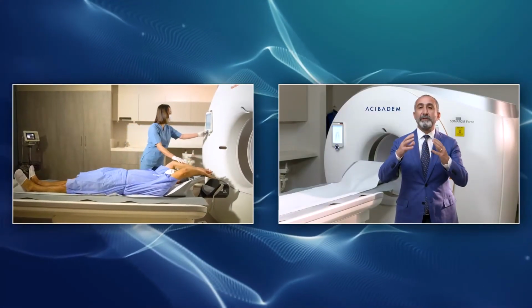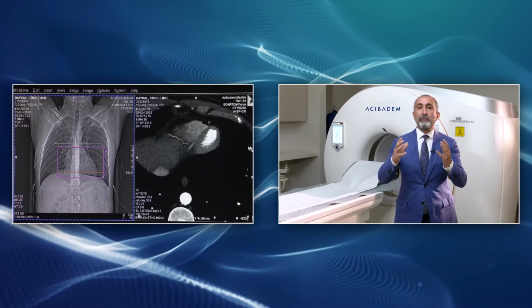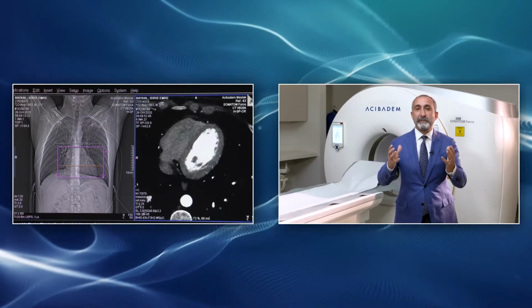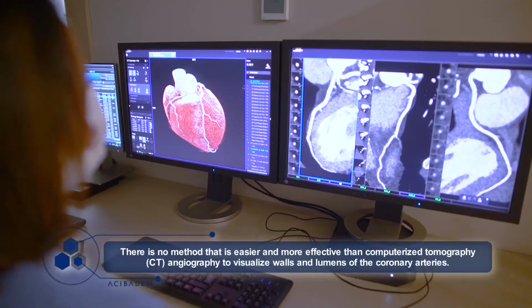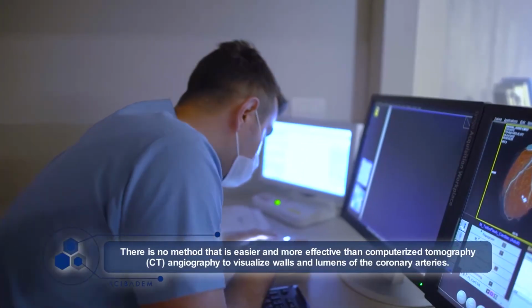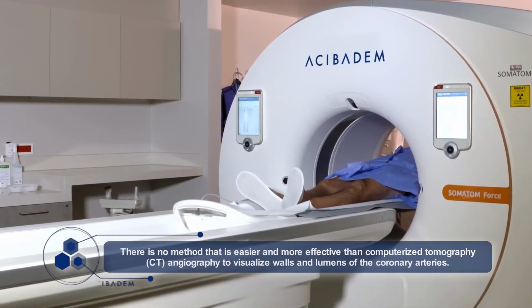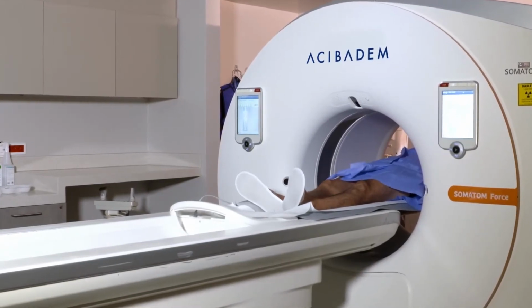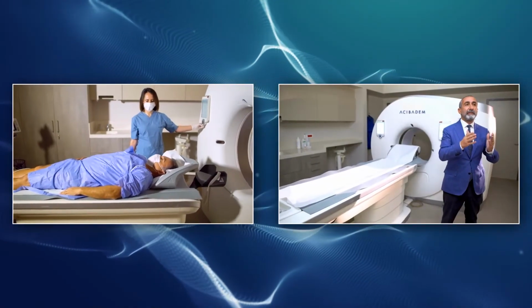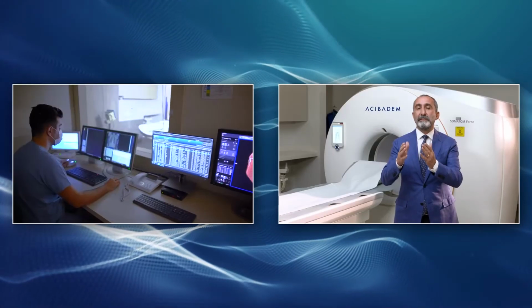Angiography with computerized tomography is the method that poses the lowest risk to examine the coronary artery and its wall in any patient. In brief, there is no modality that is easier and more effective than computerized tomography, CT angiography, to visualize the walls and lumens of coronary arteries in patients with suspected coronary artery disease. The conventional catheter angiography should be reserved for high-risk patients who have obvious treatment requirements.